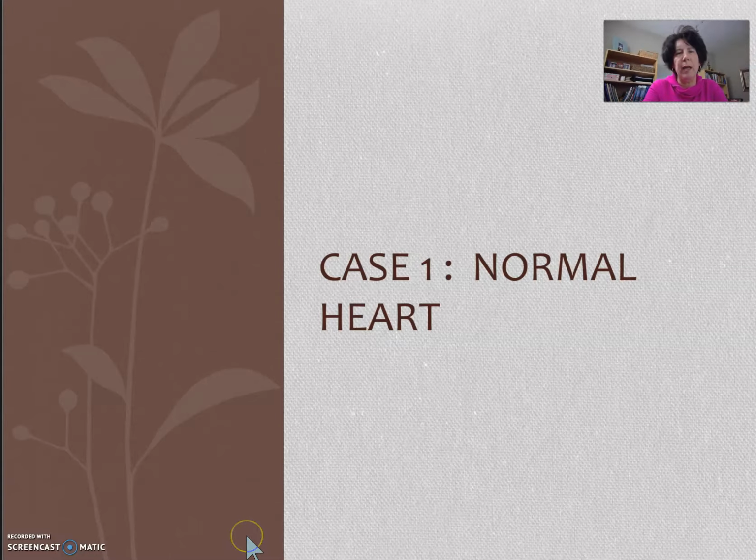Hi everybody, I'm going to do a couple of videos on point of care ultrasound. The first one will be just some examples of what the normal heart will look like.